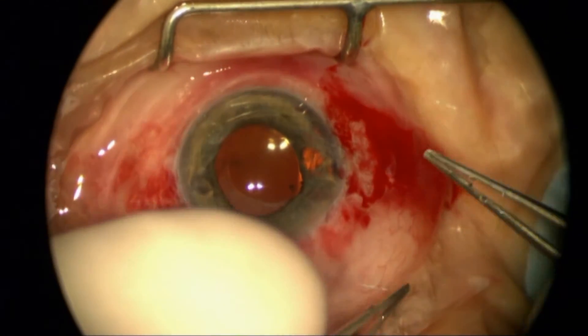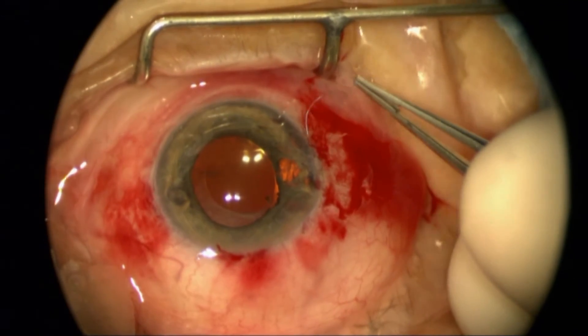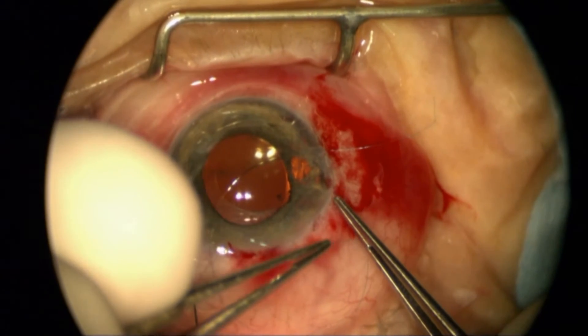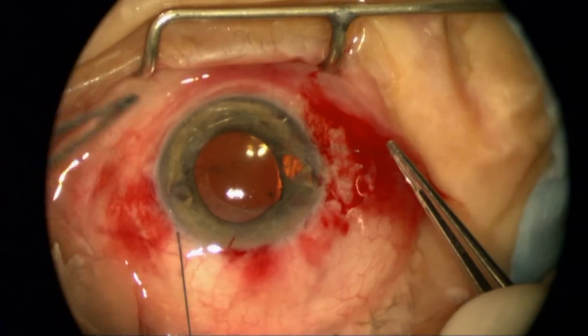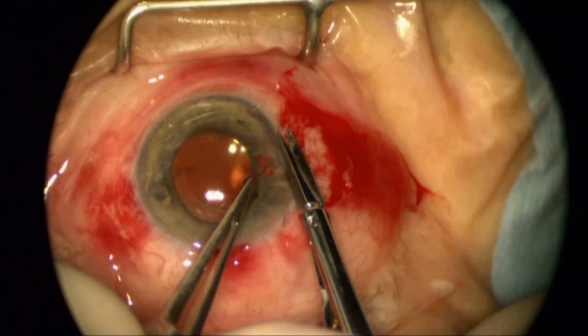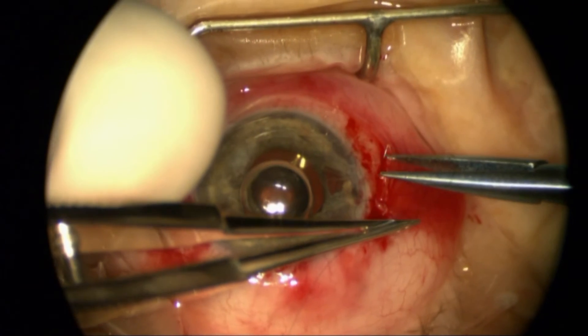I looked at closing off some of the additional openings, but the iris is so atrophic in that area that it would eventually just cheese-wire through. I don't want to create a worse situation with hemorrhage, cheese-wiring, and inflammation. So you have to know your limitations.